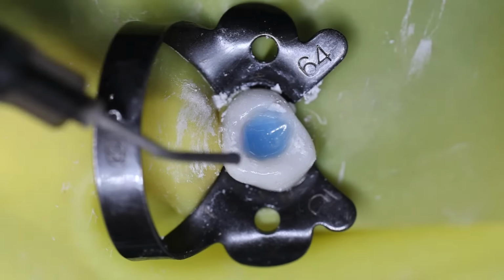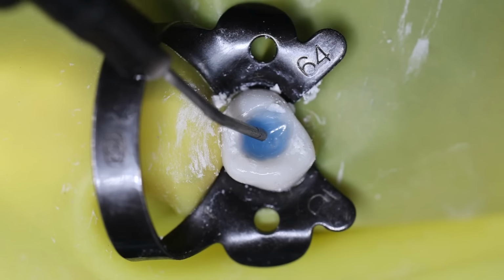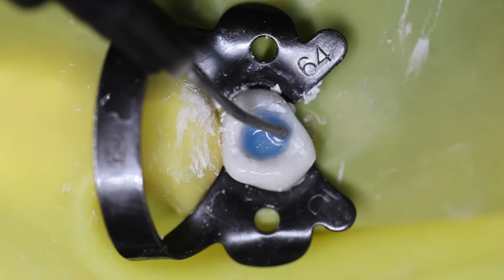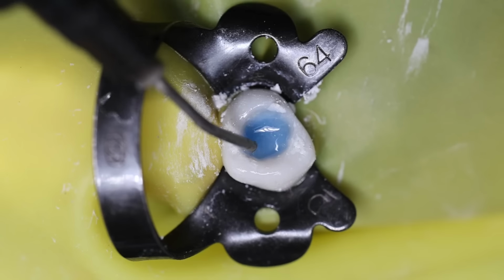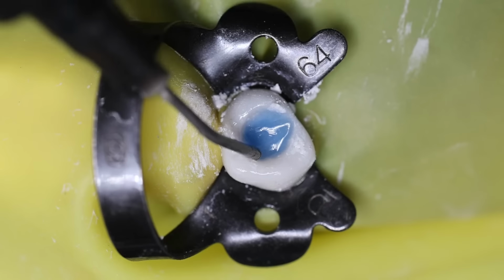Now the next layer or the next increment can be done over this, and let it flow, let it settle according to the anatomical aspects of the tooth. Whatever the cavity we had prepared, it will settle on its own.